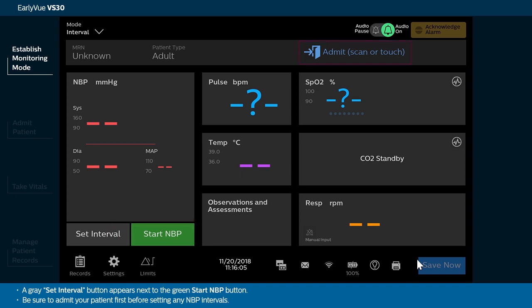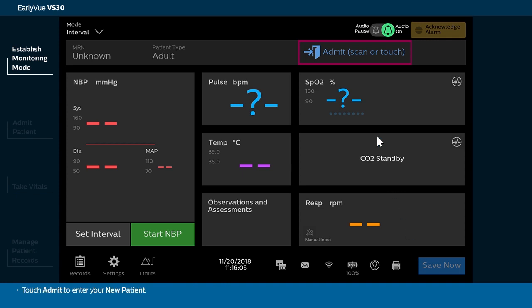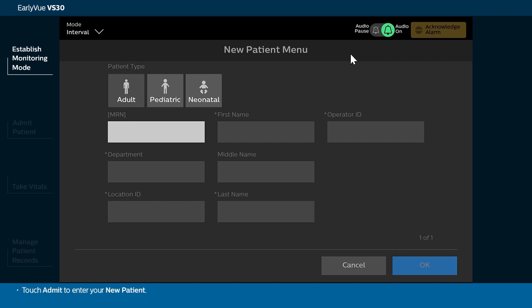Be sure to admit your patient first before setting any NBP intervals. Touch Admit to enter your new patient.